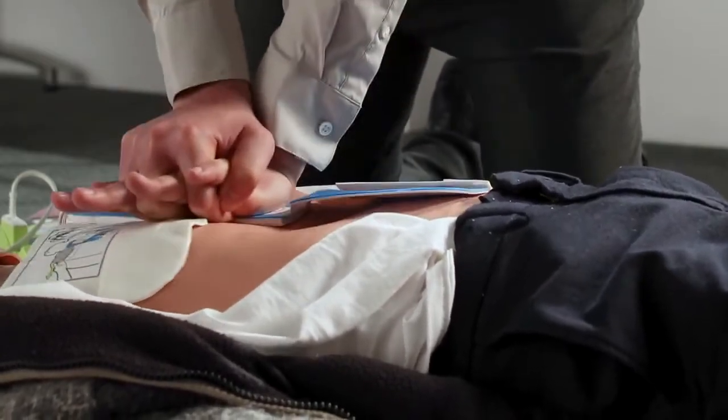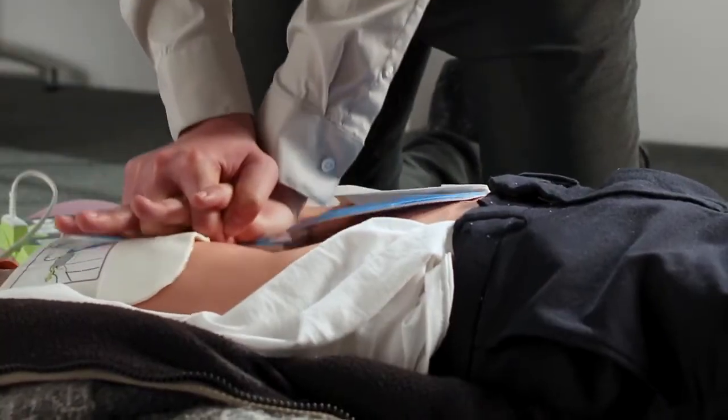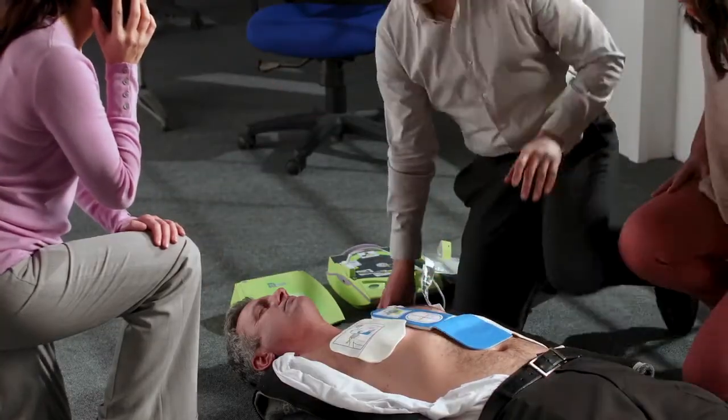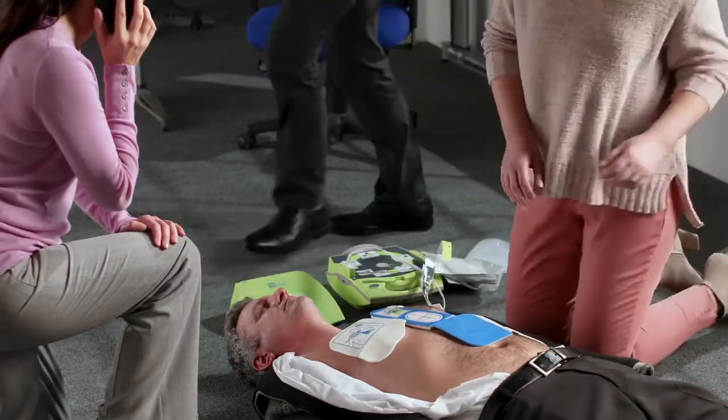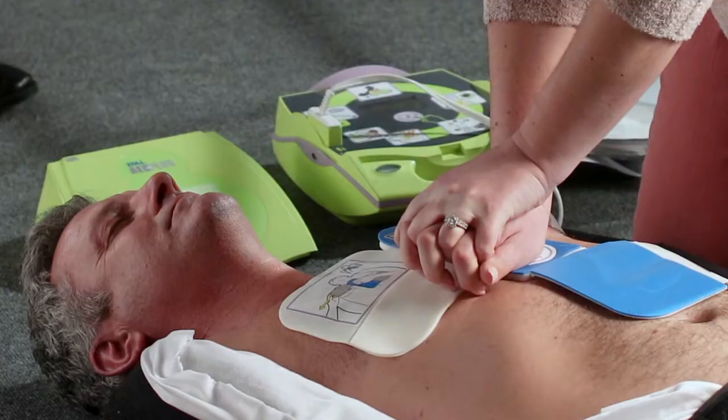Continue doing CPR until a patient regains consciousness or emergency services arrive to take over the rescue. Rescuers can tire when performing CPR. Guidelines recommend that when possible, rescuers take turns performing CPR to help maintain CPR quality.